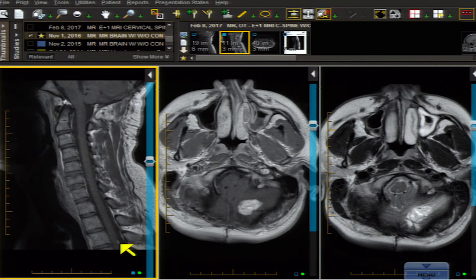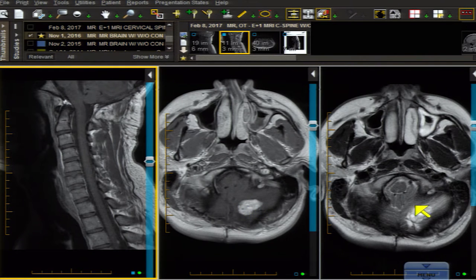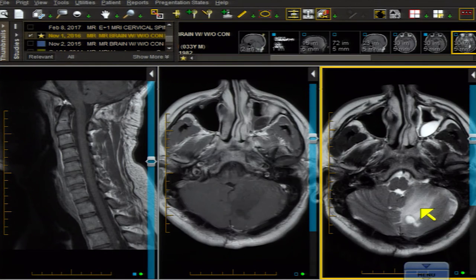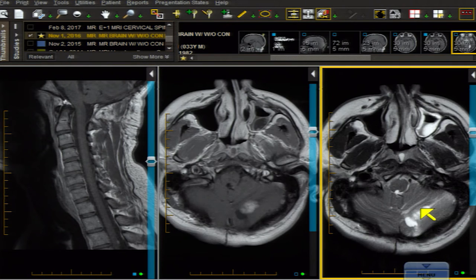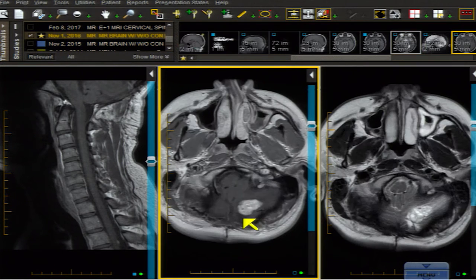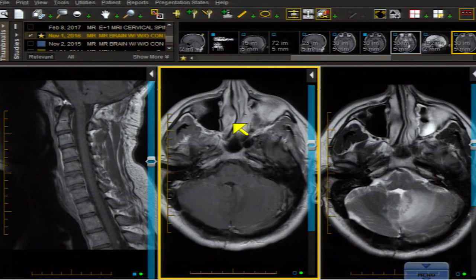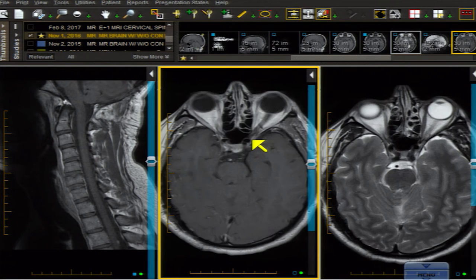This patient has a spinal and a cerebellar hemangioblastoma. There it is again on the axial T1C+, and there it is again on the axial T2-weighted image with a little flow void within it, which is one of the characteristics of hemangioblastoma, along with the enhancing hypervascular nodule and the cystic component. So you have to at least consider — and in fact favor — the diagnosis of von Hippel-Lindau syndrome with multiple hemangioblastomas.